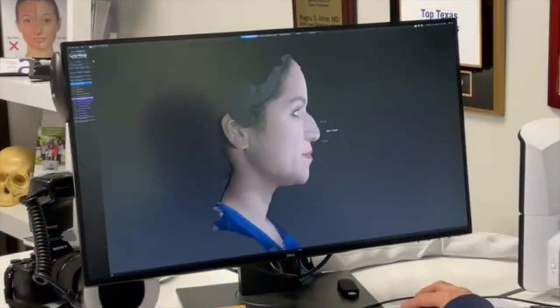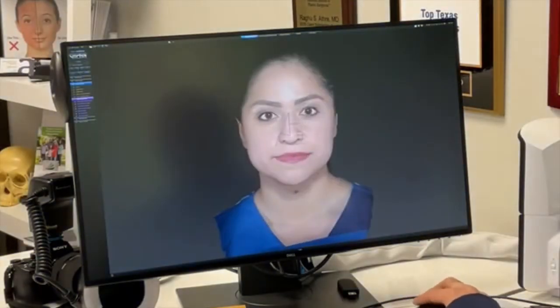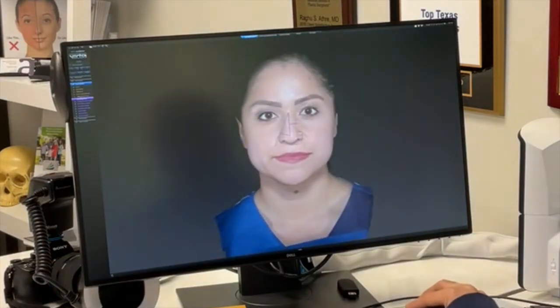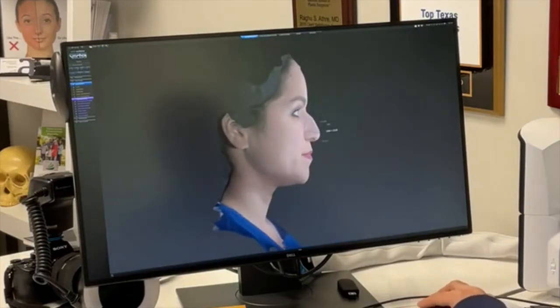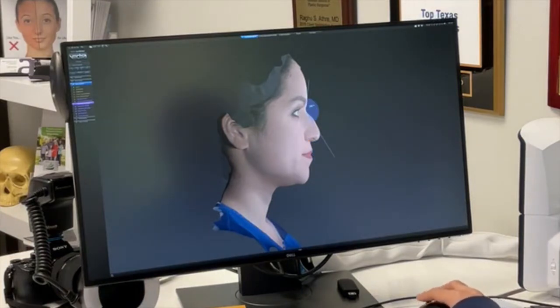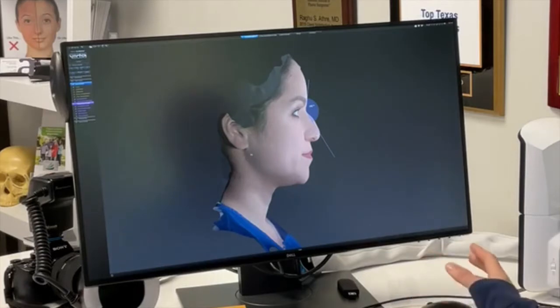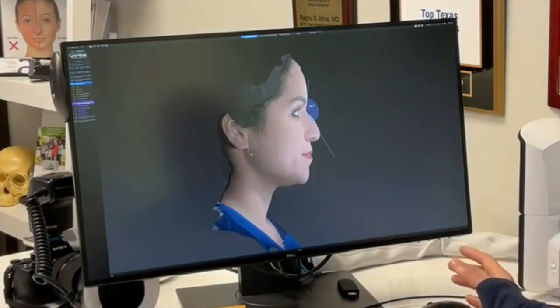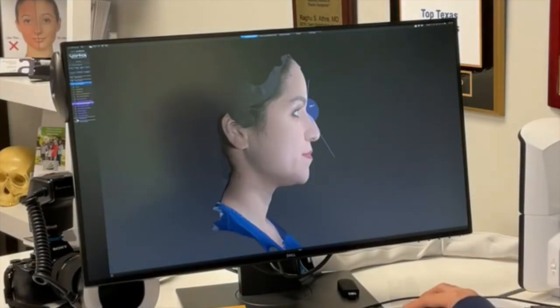Here is our original 3D model. The first thing we have is some of the calculations we use in order to do an appropriate rhinoplasty — things like the nasal labial angle, the nasal angle to the face — all of these various measurements that we use when calculating the appropriate aesthetics of a rhinoplasty.